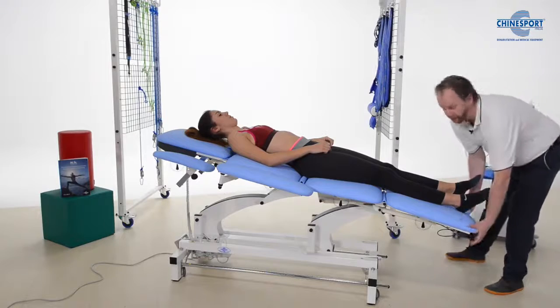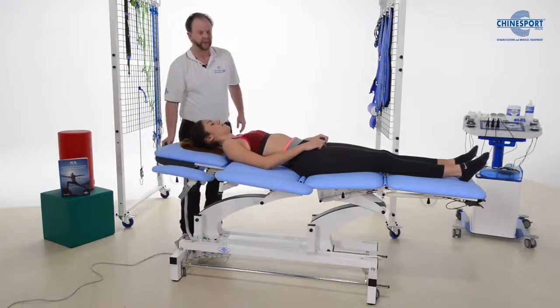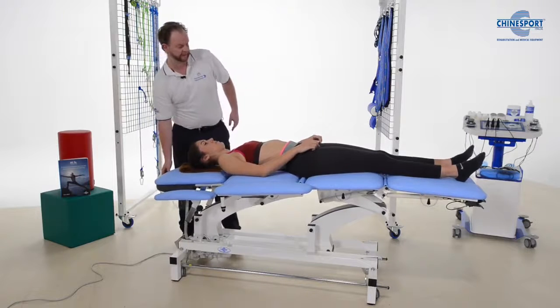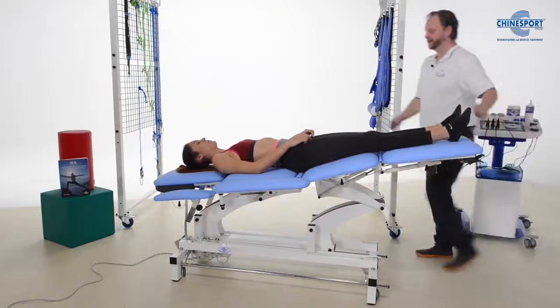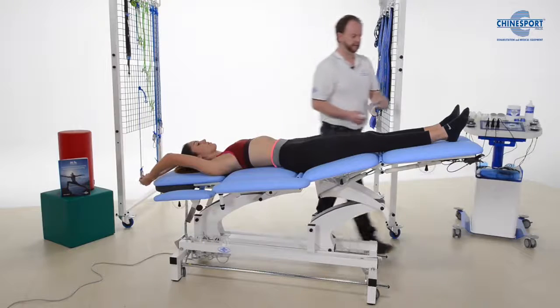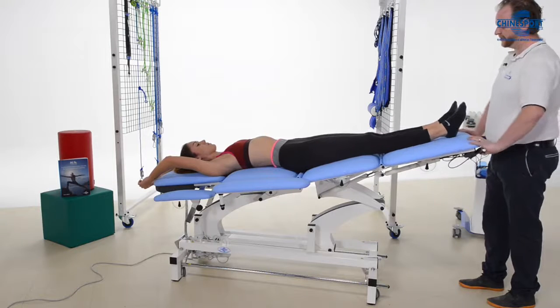Or if we want, we can reverse the traction and we can use the thorax and the weight of the thorax, the gravity, to then have some traction as well. And if she lifts her hands up, that would be nice, a bit of traction. We can increase that a little bit.